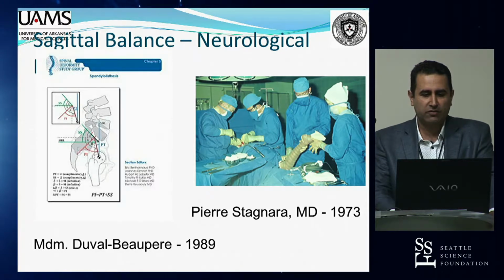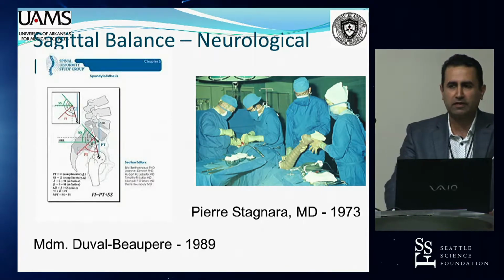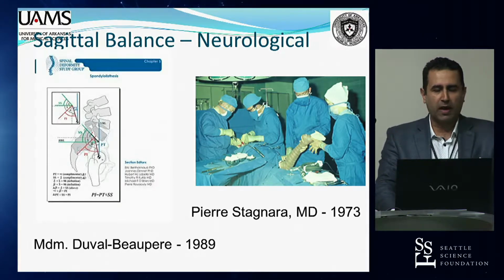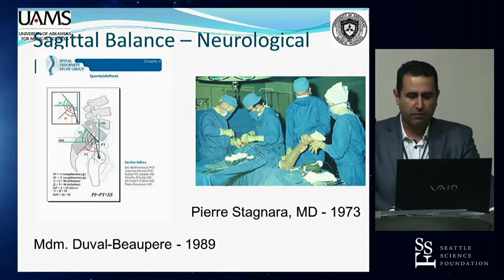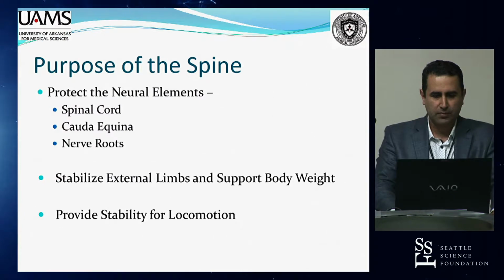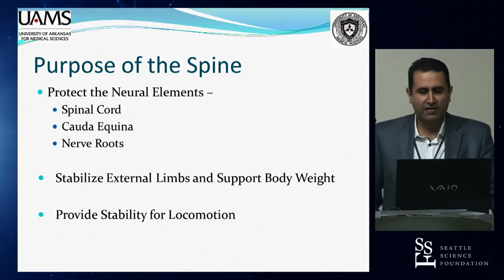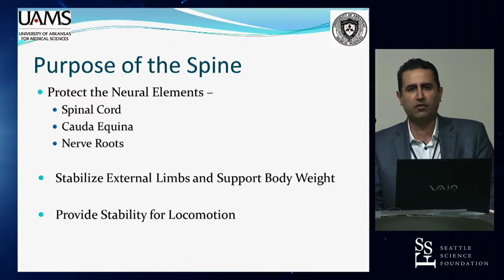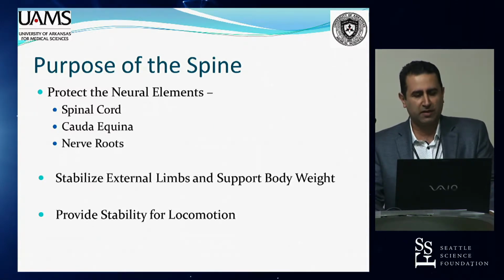This came all the way from many, many years ago. And in fact, it was really surgeons that propelled the advances here in deformity correction, as opposed to any proprietary company or other groups. So the evolution of these techniques really came with the evolution of surgical understanding. So if you understand that, the next question that you have is, well, what is the purpose of the spine? What is it that we're actually utilizing this instrumentation for?